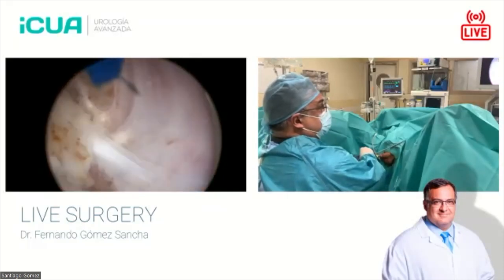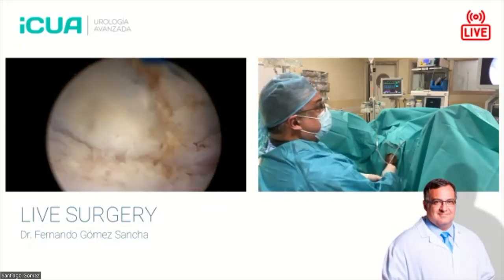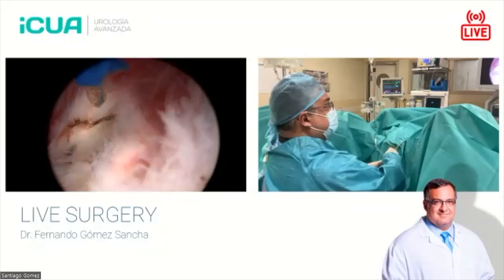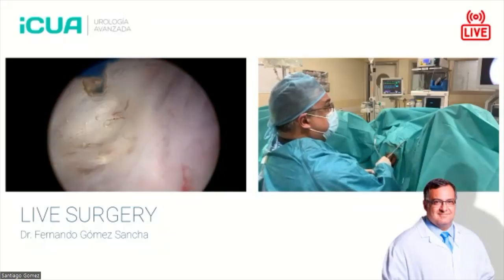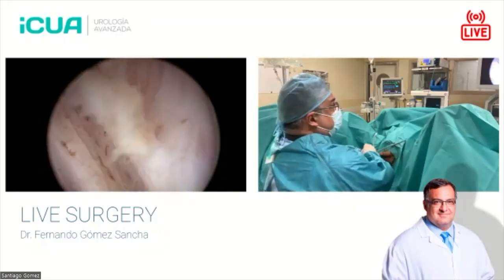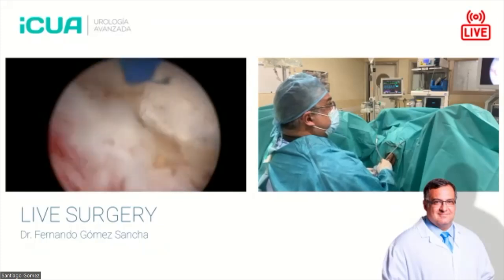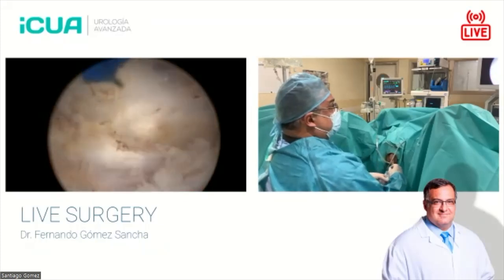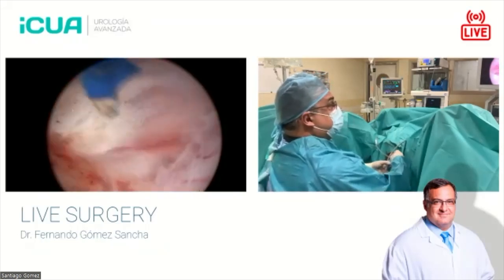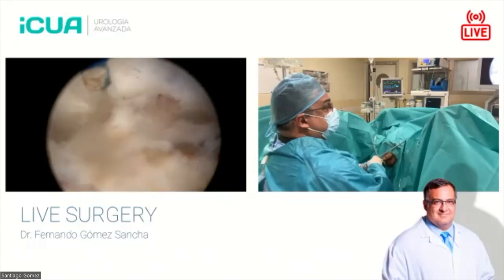Now you see we have constructed a nice anterior line that we can follow. So I'm going to try to see if I can connect this line with the lateral line. You see this is the lateral line. Now this is more anterior, and you see now the operation becomes a piece of cake, because we have a nice line that goes around the adenoma, and our only concern is to check the quality of the plane. If the plane is very good, we just have to follow the line. And we have to concentrate on where we aim the laser.